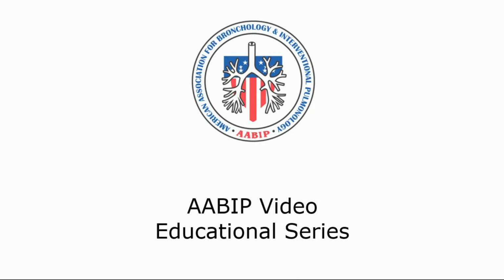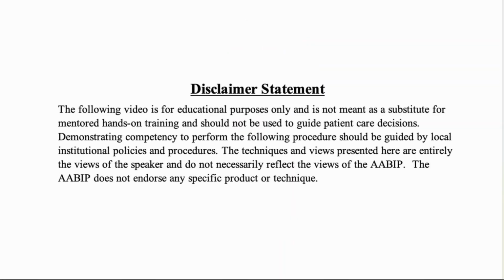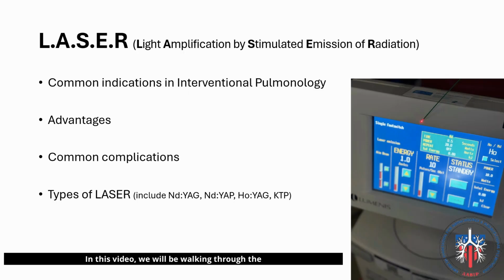AABIP Video Educational Series, Endobronchial Thermal Ablation with Laser. In this video, we will be walking through the essential technique and safety steps involved in performing a laser procedure in the airway using a bronchoscope.